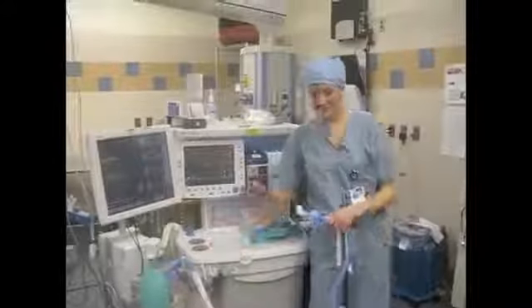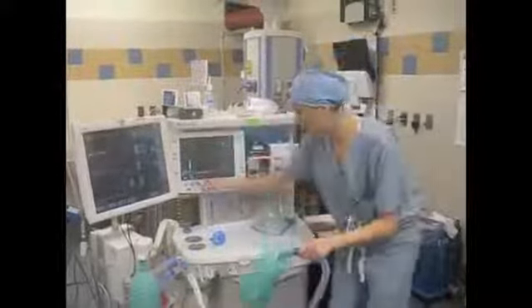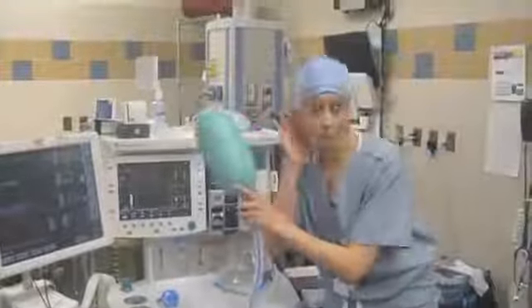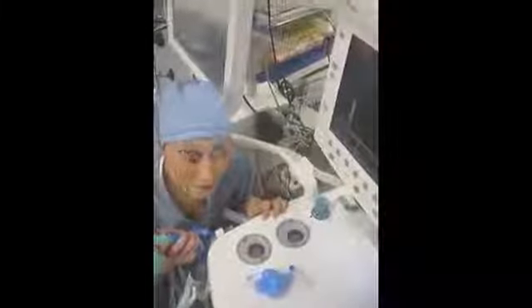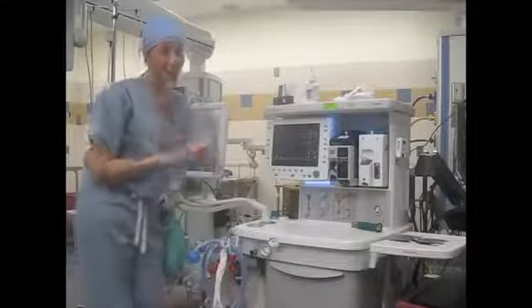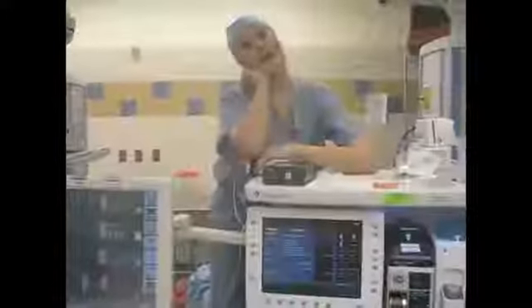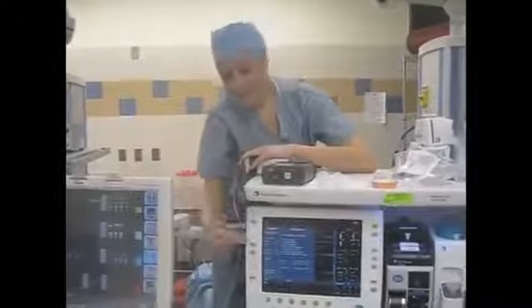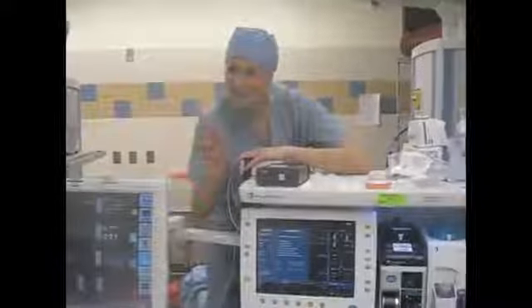Check for the vent. Make a fake lung, O2 at 4. Turn on the vent and check that there's no leaks. With each breath, the one-way valves open and close according to the timing of the breath. Let's calibrate the oxygen to air, so open it and wait until it's 21%. All these steps are checked automatically in new machines, so follow the instructions and don't fret.